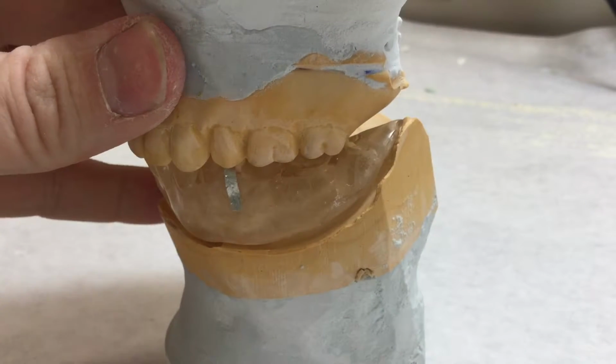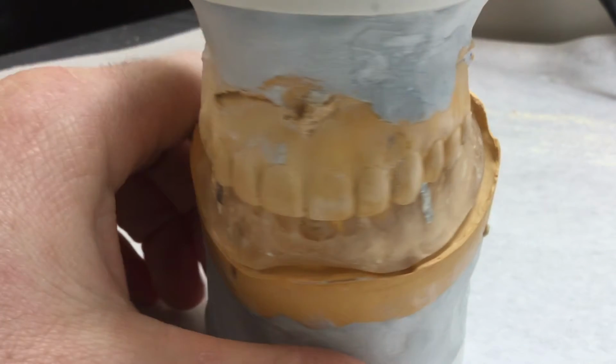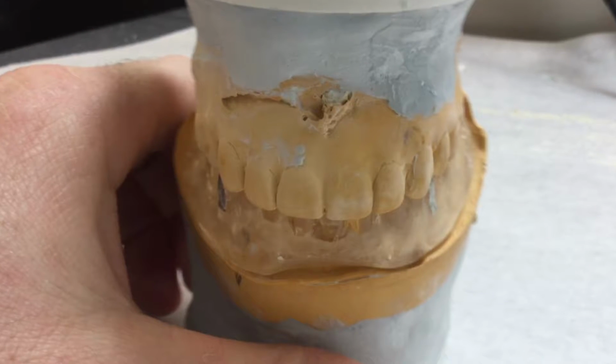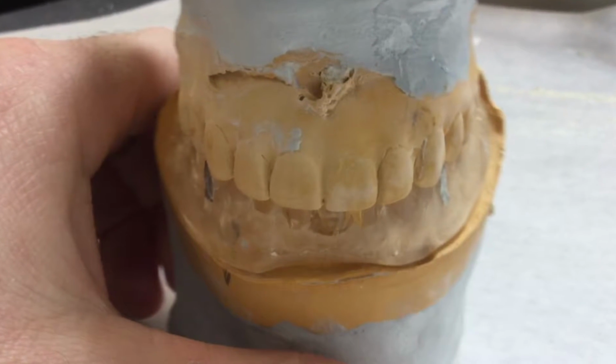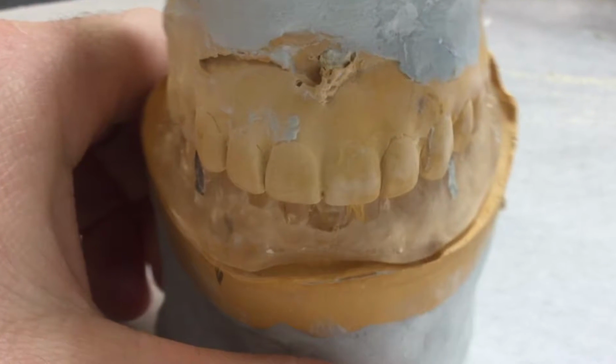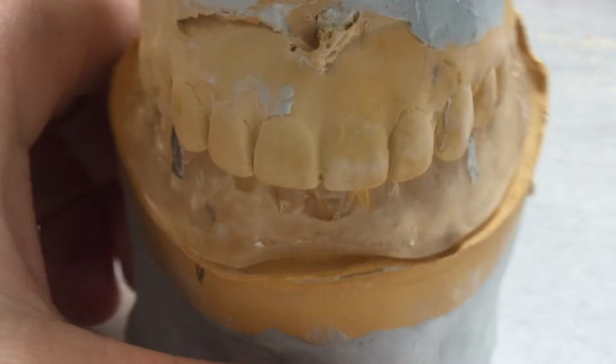Overdentures need 15 mm of space between the occlusal plane and the bone level, or 12 mm from the soft tissue to the occlusal plane, in order to accommodate this hardware. Insufficient planning will result in either poor aesthetics or inadequate denture acrylic thickness, leading to denture failure.